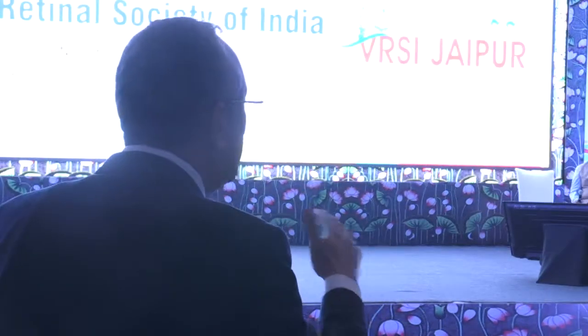So the cases which you have shown are giant retinal tears or giant retinal tear? No, there were no giant retinal breaks. I mean, with giant retinal breaks you usually get posterior slippage if you do a fluid air exchange and you have fluid still at the edge of the break. But if you do a direct PFC silicone oil exchange, which is my technique, usually I don't get posterior slippage.